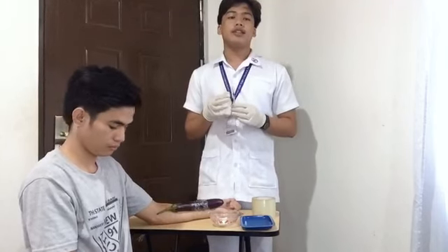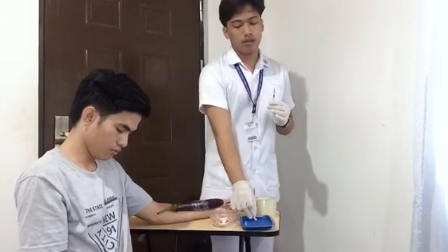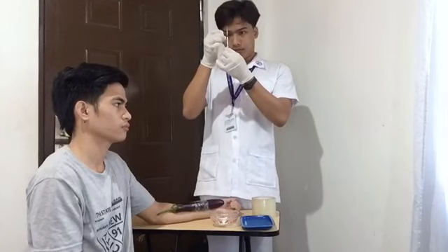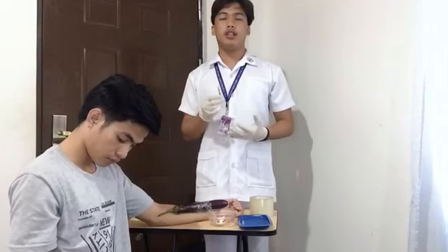Next is prepare the syringe for the injection. First is remove the needle cap while waiting for the antiseptic to dry. Next is expel any bubbles from the syringe. Small bubbles that adhere to the plunger are of no consequence. Grasp the syringe in your dominant hand close to the hub, holding it between thumb and forefinger. So hold the needle almost parallel to the skin surface with the bevel of the needle up.